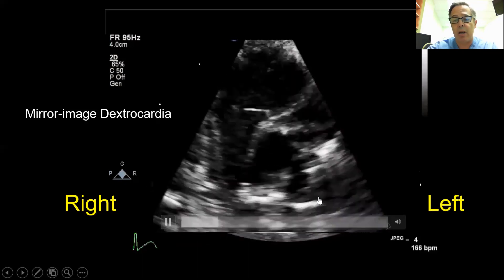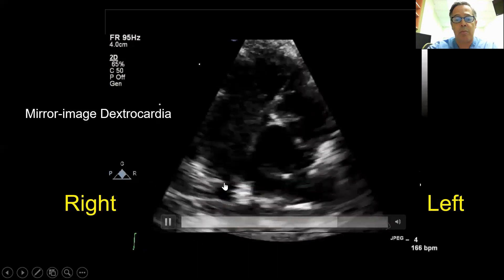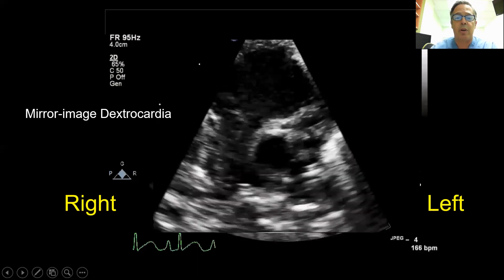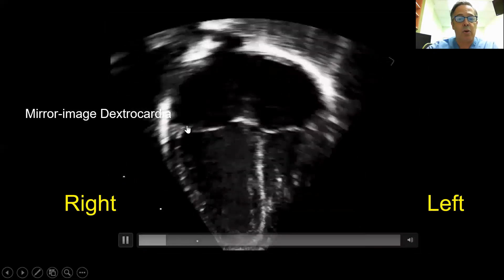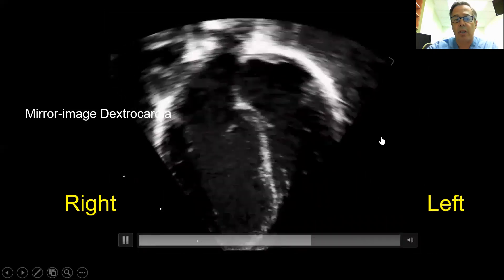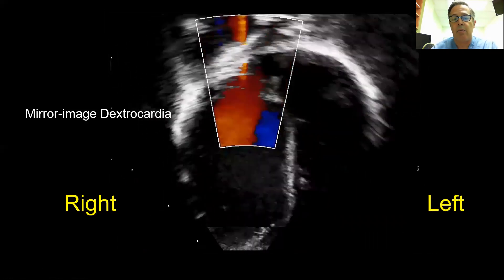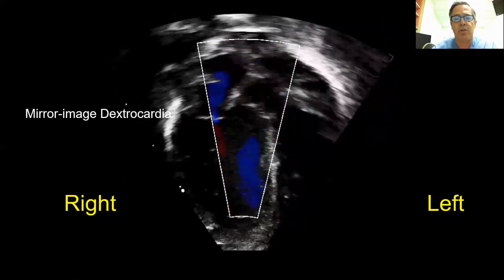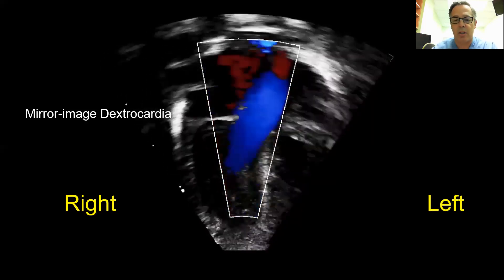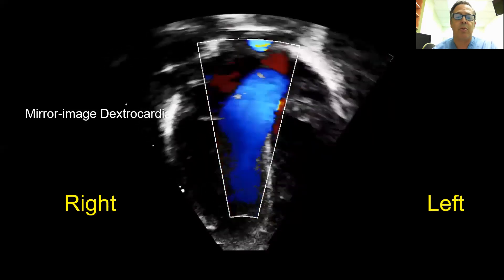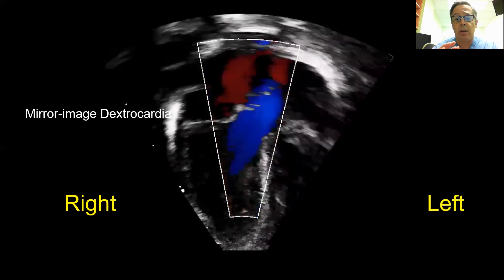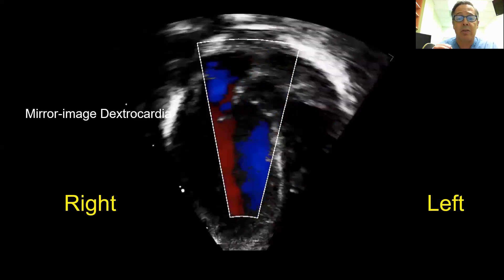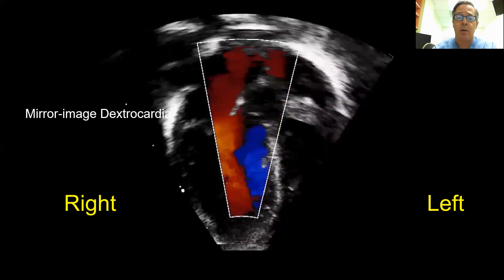You have the LPA appearing like an RPA going behind the aorta, and the RPA going off to the right lung — typical arrangement for mirror image dextrocardia. The left atrium connected to the left ventricle, but these are on the right; right atrium and right ventricle are on the left. Pulmonary veins drain into the left atrium, and we see the aorta come off in the mirrored fashion. This is the way it should look when scanning a patient with mirror image dextrocardia — it looks odd and backwards, but this is the correct way to display it.